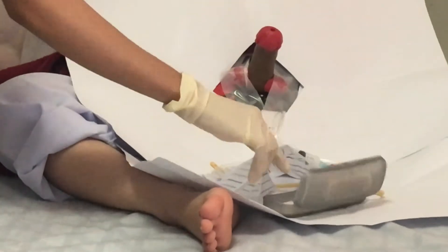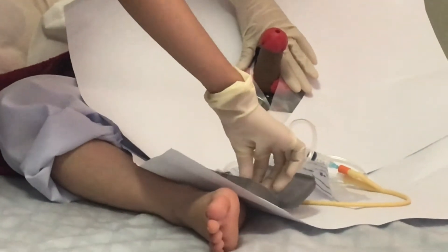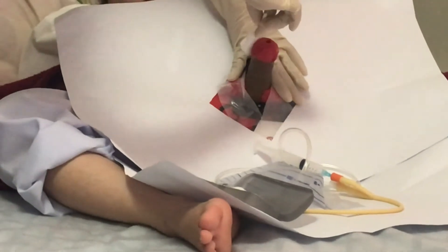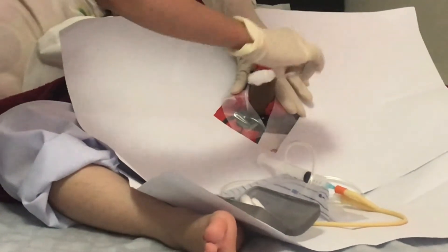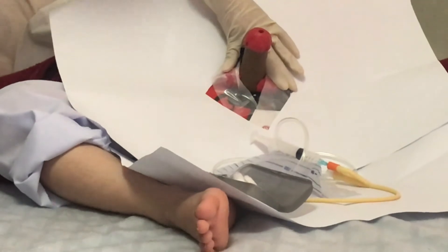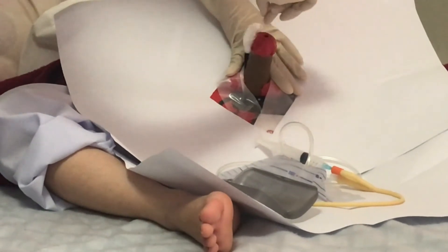With your non-dominant hand, gently grasp the shaft of the penis just below the glans. Keep your hand in place, as it is now contaminated. If uncircumcised, use the same hand to retract the foreskin. With the sterile dominant hand, clean the meatus with antiseptic solution, swabbing outward in a circular motion to the base of the glans. Do this three times.